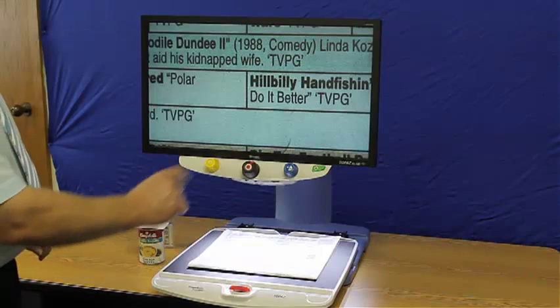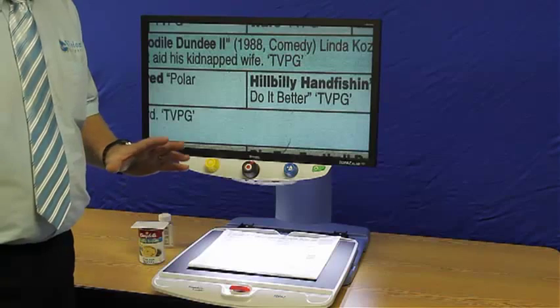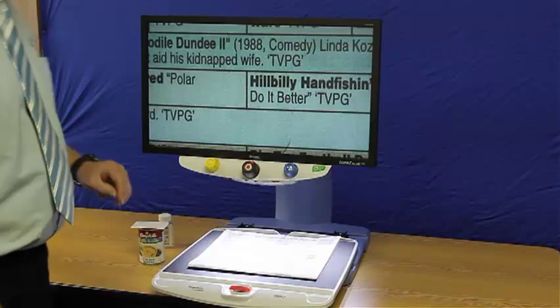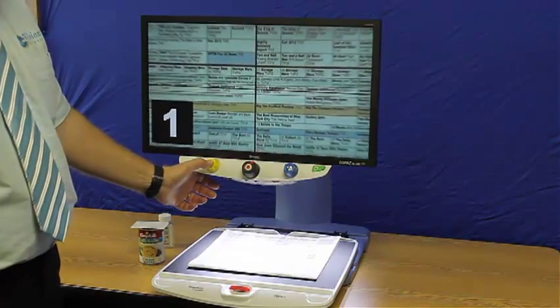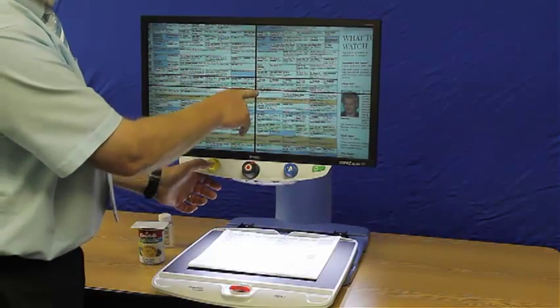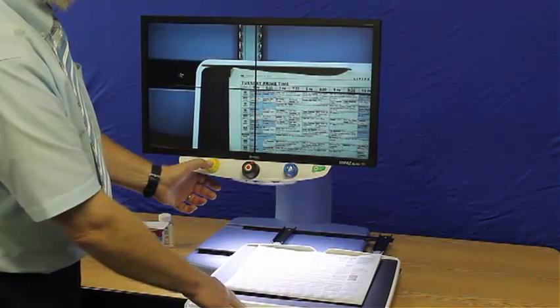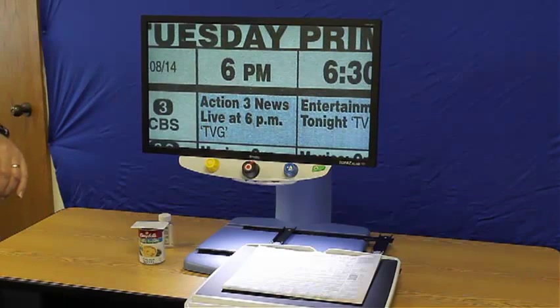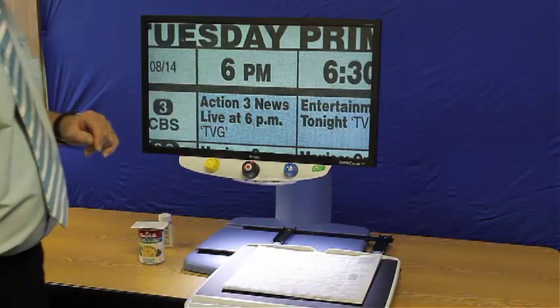Okay. Now, let's say we're using it at that magnification, but we want to look at the very top left. We could just move the table to get there, or if we push this yellow button here, we can zoom out. It zooms all the way out, puts crosshairs. Now we put the center of that where we want to look. So we want to look at the very top here. I release it, and it goes back to the magnification that we were at. That eliminates us turning this knob back and forth all the time.